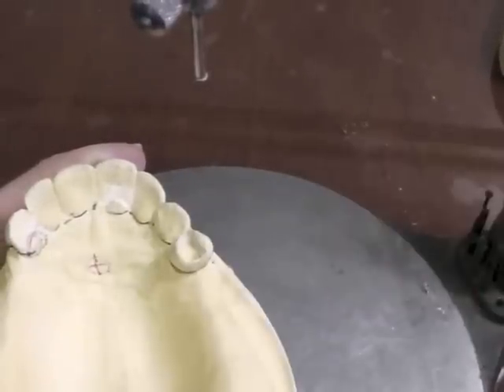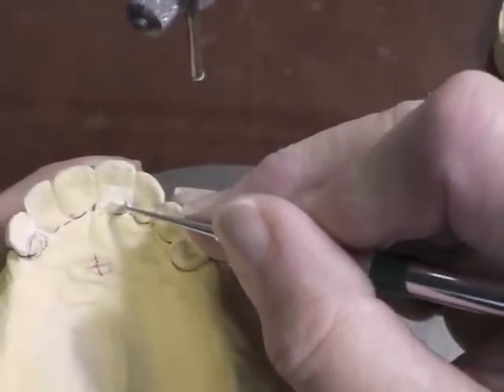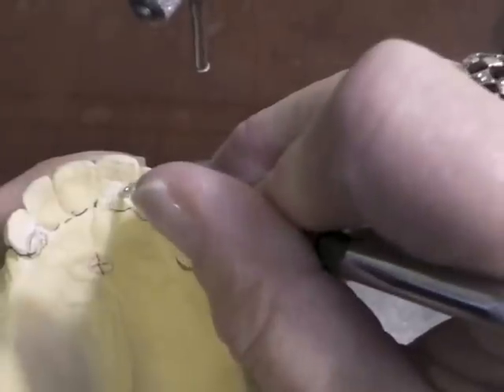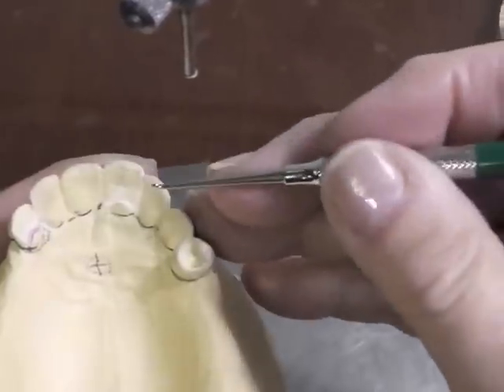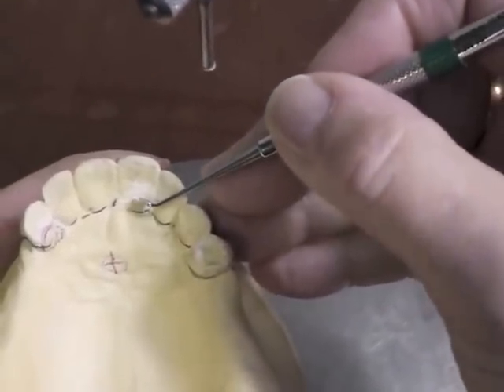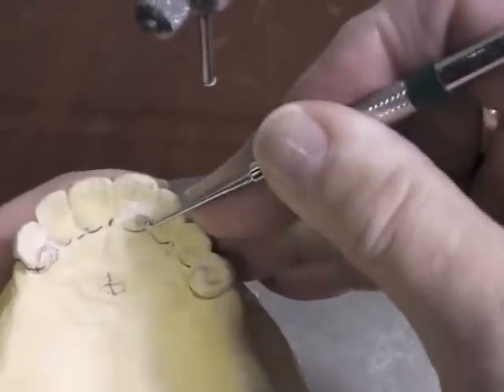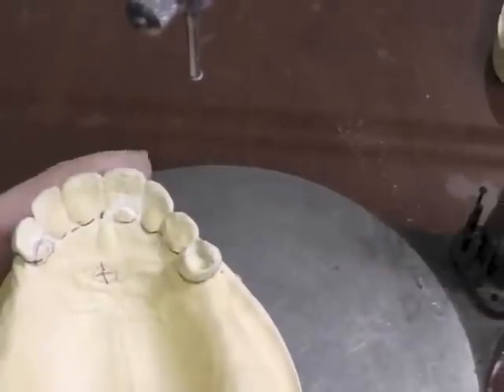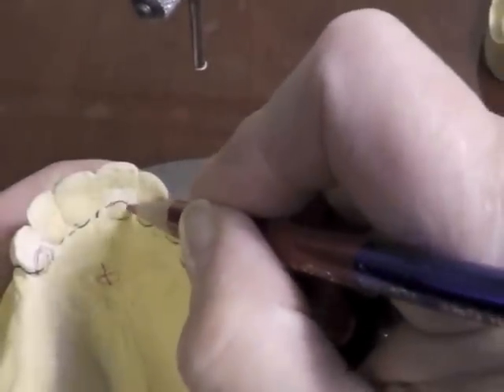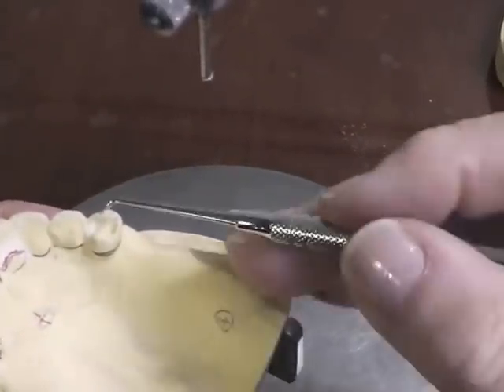We called for an indirect retainer, which is a rest on our central incisor. Same thing: you can use that inverted cone, come in from this angle, and create a ledge. The inverted cone does create a positive seat, but I find it harder to control in the mouth upside down. I prefer a tapered diamond that is end-cutting, where I cut my little ledge with the end cut, then turn the burr sideways to remove any undercut.